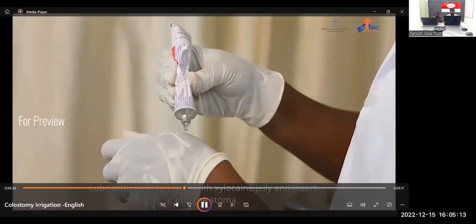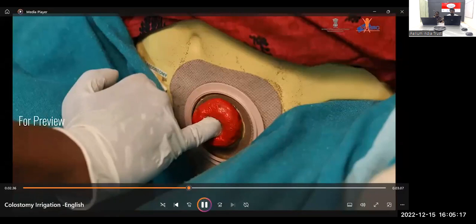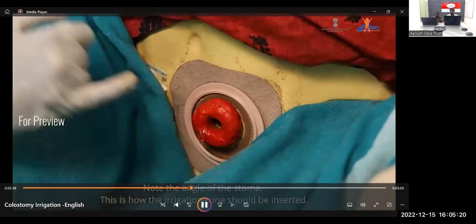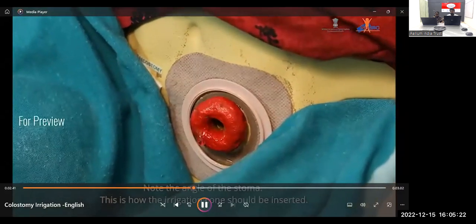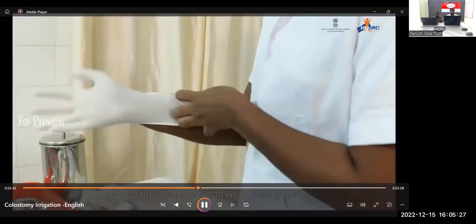Lubricate the little finger with xylocaine jelly and insert it into the stoma. Note the angle of the stoma. This is how the irrigation cone should be inserted. Discard the used gloves and wear clean gloves.